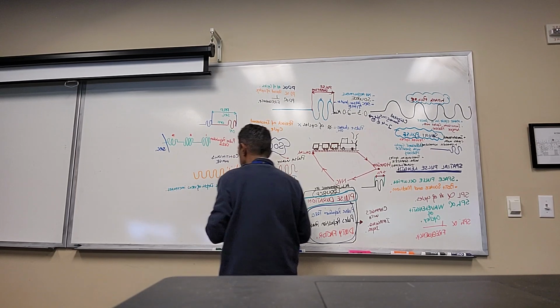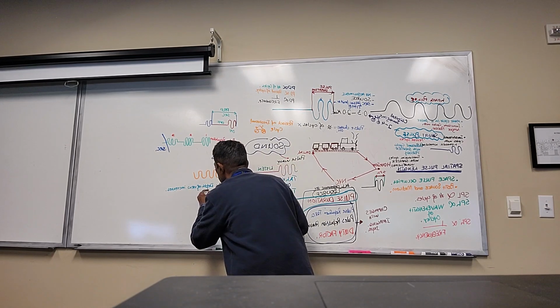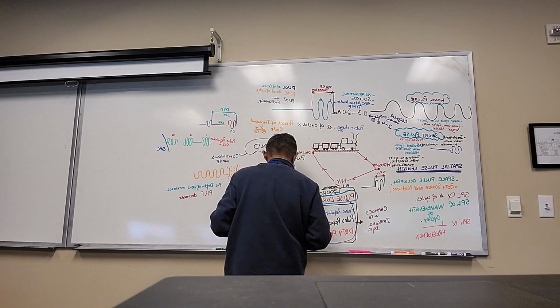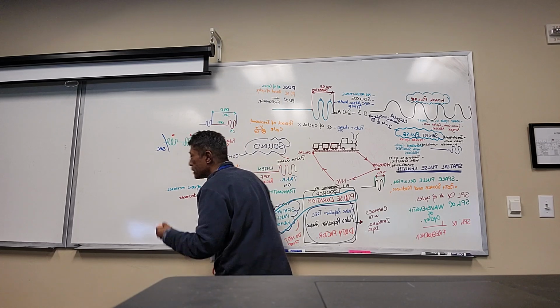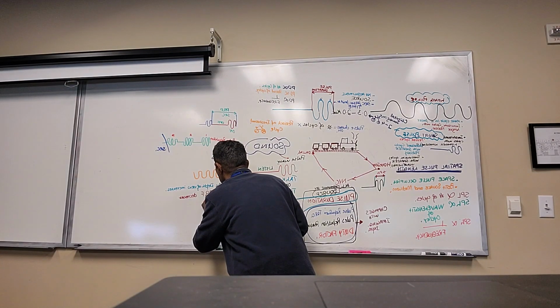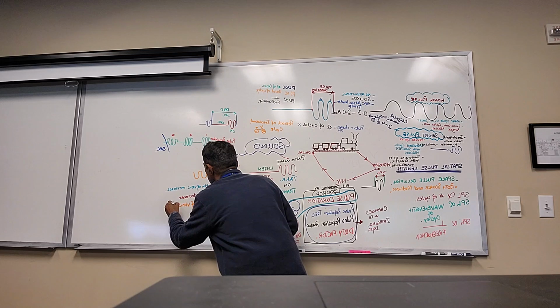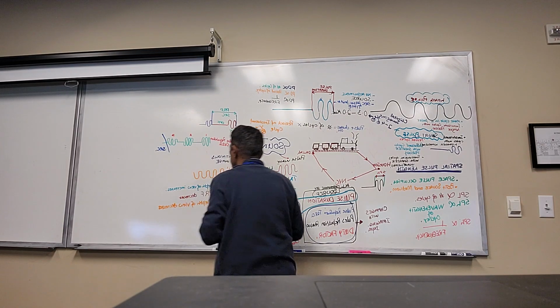This is a very important relationship. As depth of view increases, PRF decreases. As the depth of view decreases, what's going to happen to PRF?